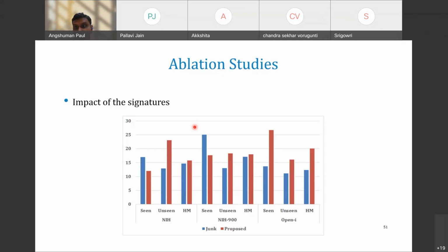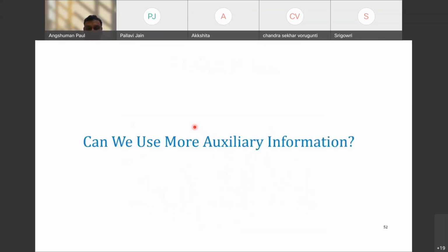So actually, what we are doing is we have an image. From the image we are computing features, and similarly from the description of the diseases like pneumonia, etc., we are computing the embeddings. So word embeddings based upon the text, and features based upon the image, we are combining both to achieve zero shot learning. Right, zero shot learning, not one shot. Yes. Thank you, sir.